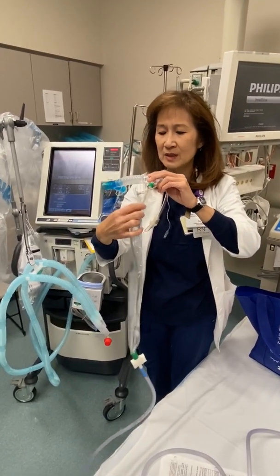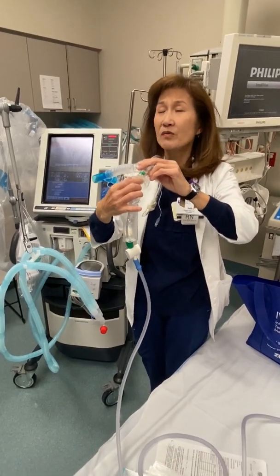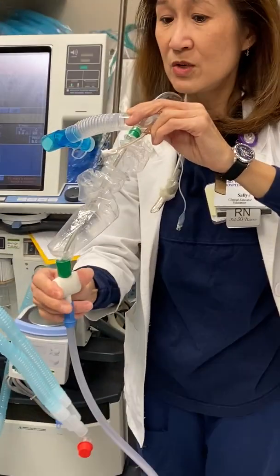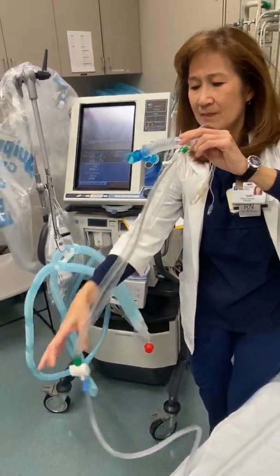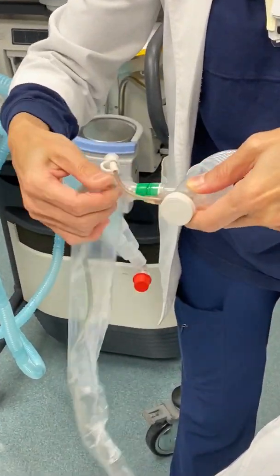All you have to do is advance this inline catheter all the way in. Now when the patient coughs, all you have to do is press on this white knob. It has 80 to 120, and you wiggle around to bring it out of the ET tube. All right? There is a black dot on this inline suction.